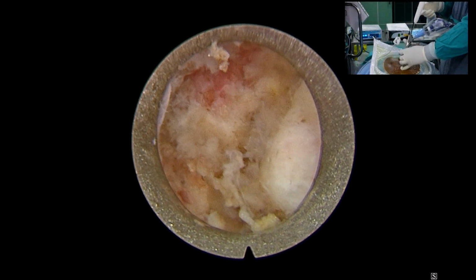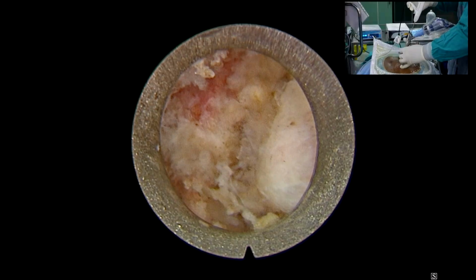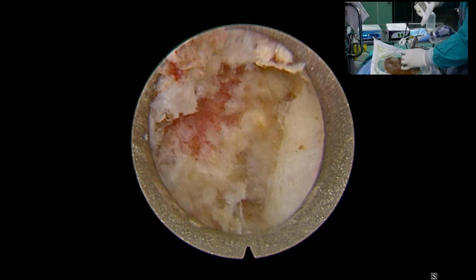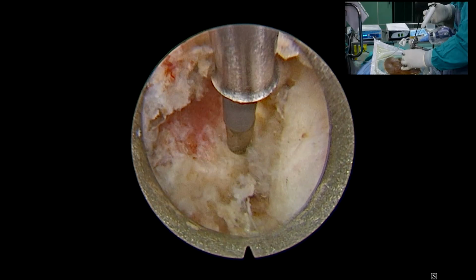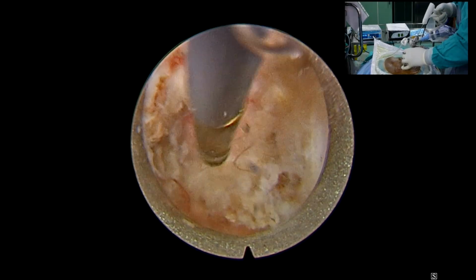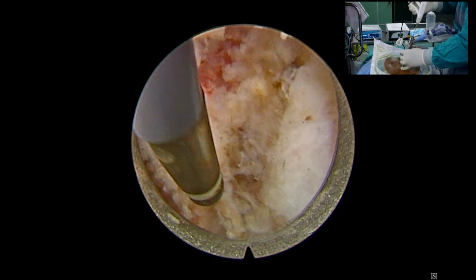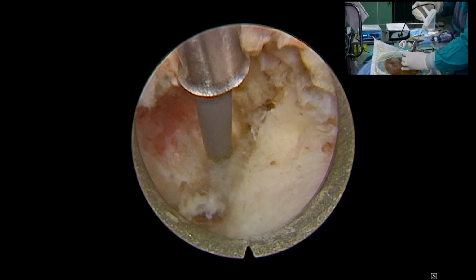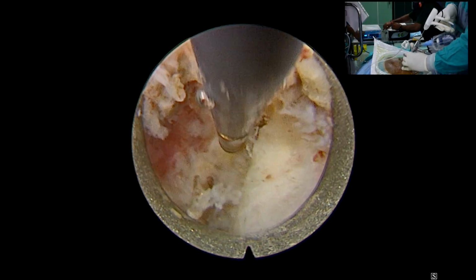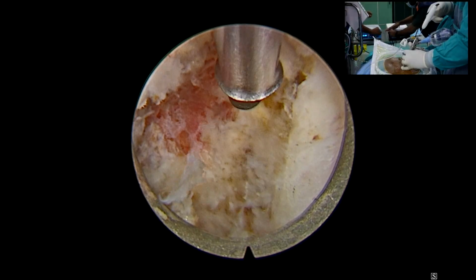The flavum also has got two layers to it. The outer one is the thick yellowish structure that you see. Generally what we try to do is put an annulus cutter, create a space in the ligamentum flavum, and then remove the entire ligamentum flavum. Ideally, we see both the layers. The inner flavum will be a little duller yellowish, or less yellowish.